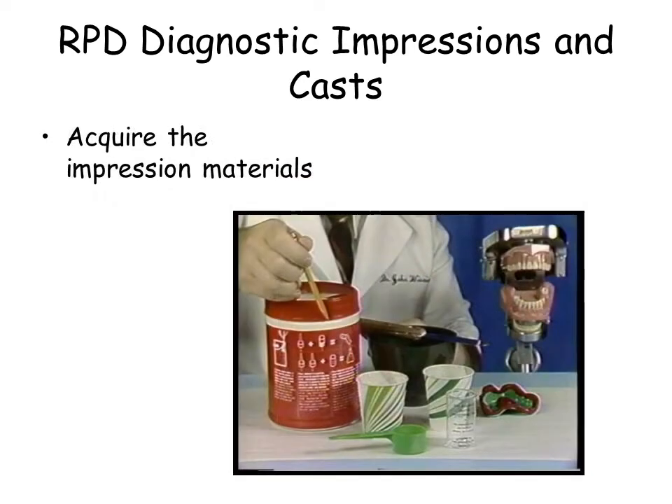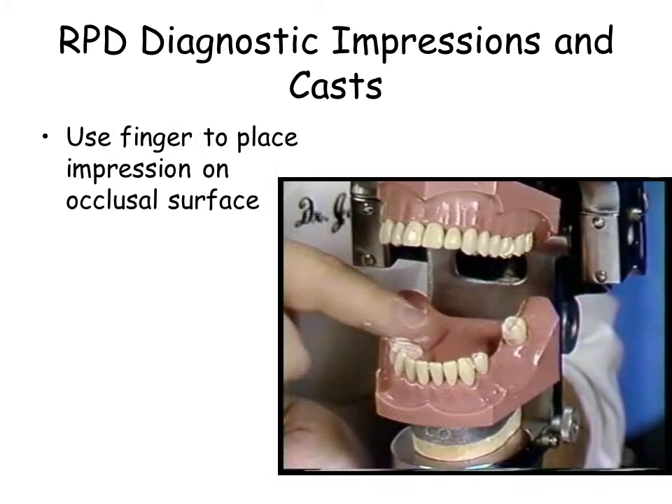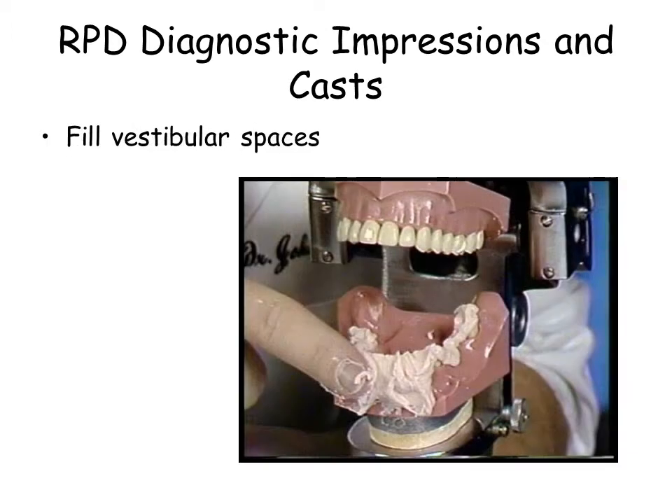Use 3 to 4 scoops of alginate. Using your finger, apply the impression material to the occlusal surfaces of the teeth. Additionally, fill the vestibule with impression material.